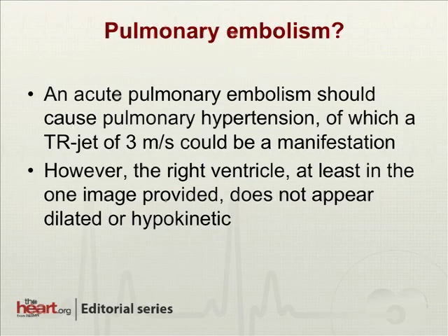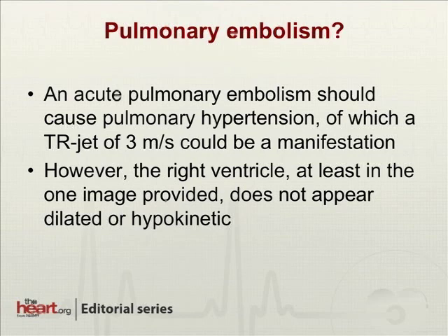Pulmonary embolism? Certainly a pulmonary embolism could cause a degree of pulmonary hypertension. If it's a first pulmonary embolism, typically the PA pressures don't go much above the mid-50s. However, the right ventricle in the apical four-chamber image does not appear to be dilated or hypokinetic in any way — it looks as vibrant as the left ventricle. So that's not quite as likely.